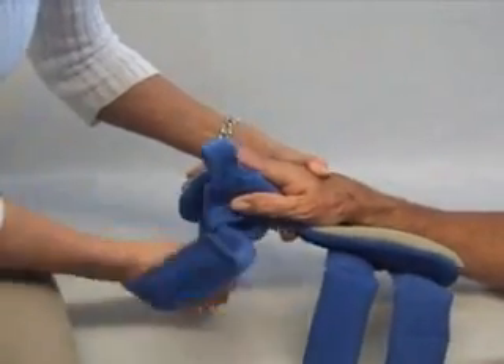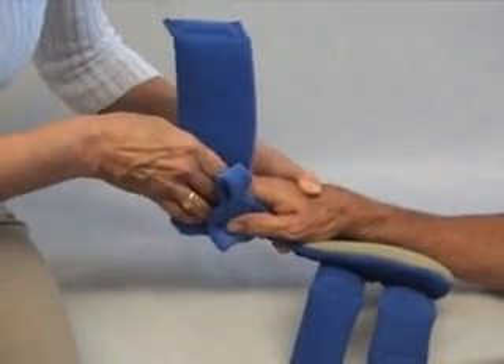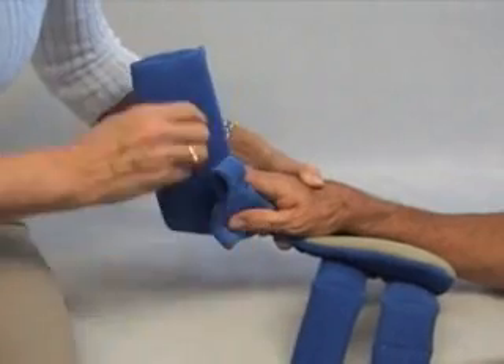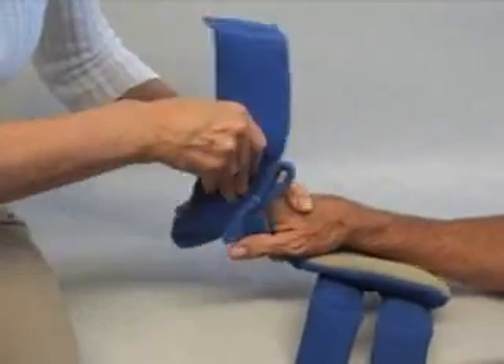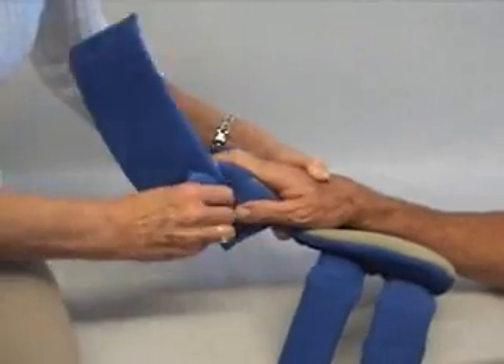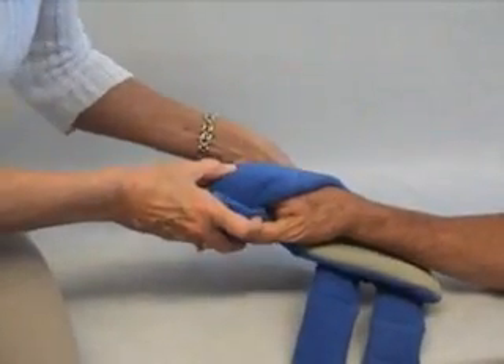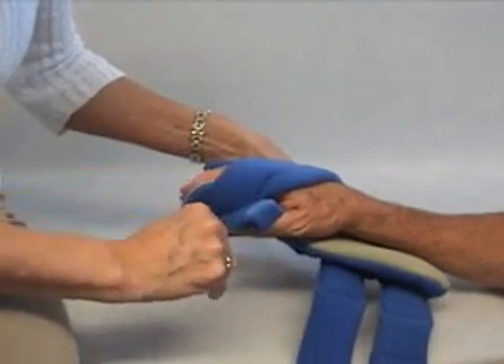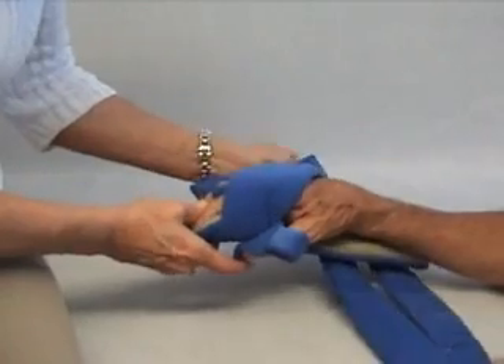When you're doing the finger straps, it's a 3-inch wide strap. Again, you don't want to put undue stretch on that thumb. You might just bring it up here or it might come down. You're going to bring it over the back of the hand if the patient is pulling back, or over the fingers — whichever is appropriate for your patient.